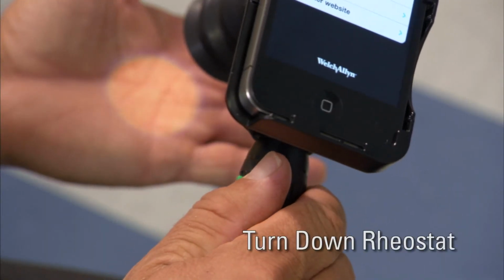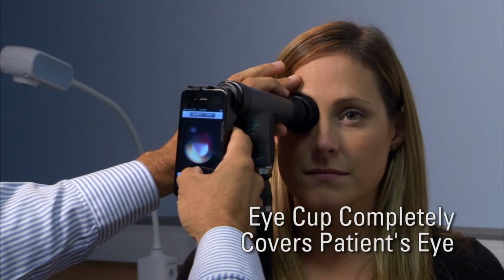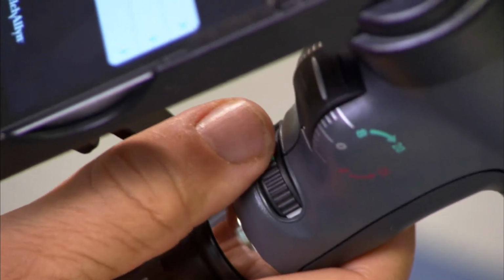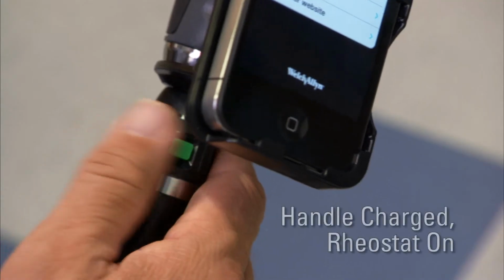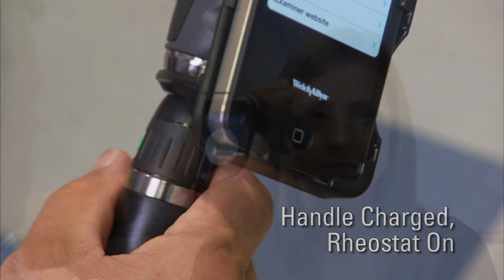Turn down the rheostat on the handle. Make sure the eye cup is completely covering the patient's eye. If no light is coming from the scope, make sure the aperture switch is not stuck between apertures. Make sure your handle is charged and the rheostat is turned on.